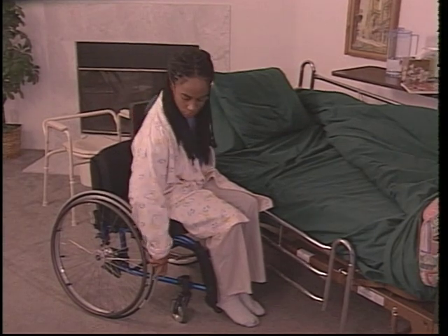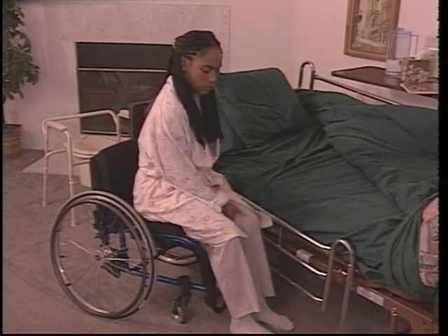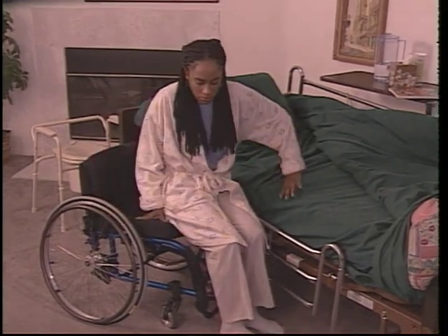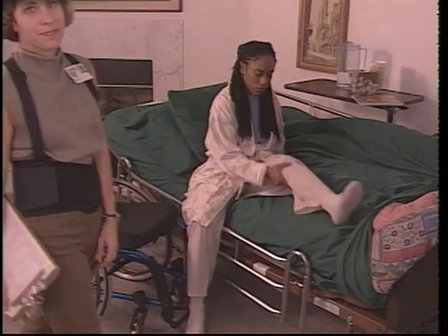Many patients with disabilities move their bedroom to the first floor. This patient, for example, has put an adjustable semi-electric home care bed in her living room to be as close as possible to her bathroom. That provides greater efficiency of movement. Efficiency that promotes safety is the guiding principle when reorganizing rooms and placing appliances such as telephones.